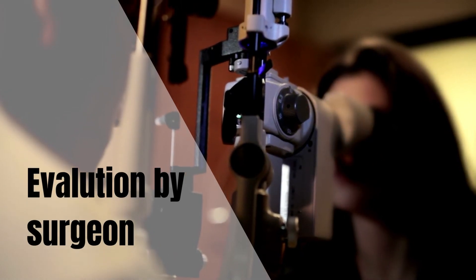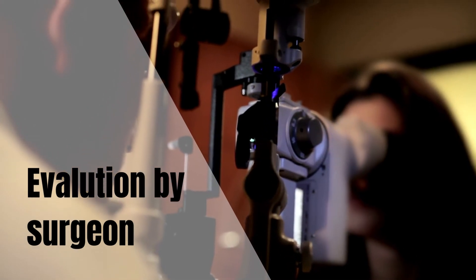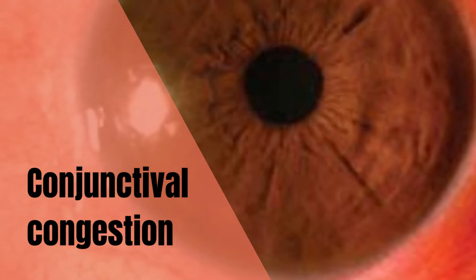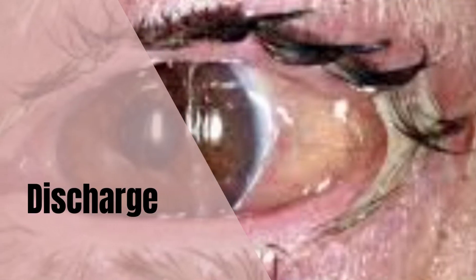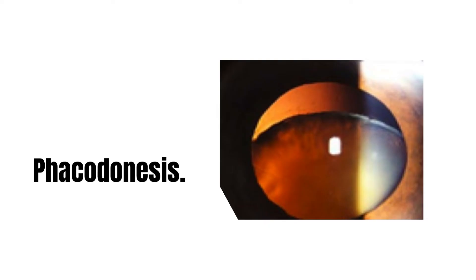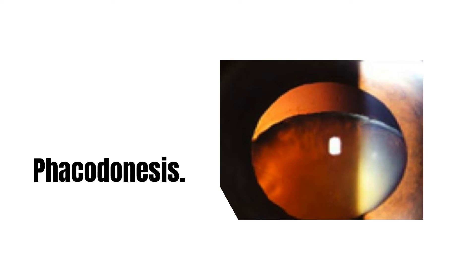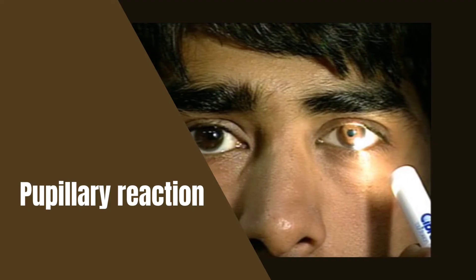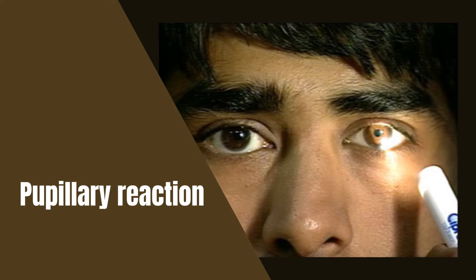Slit lamp examination should be done to look for the following important findings: conjunctival congestion, discharge, cornea and anterior chamber depth, lens opacity and phacodonesis. You must also assess pupillary reaction to rule out posterior segment disorders.